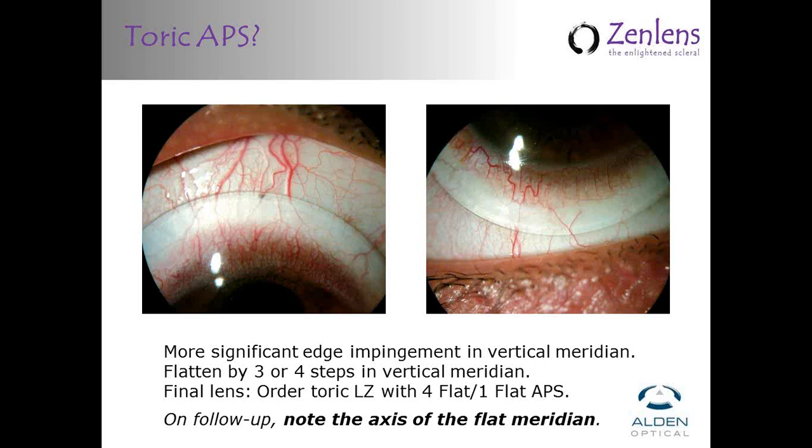And also, perhaps even more important, is if the eventuality comes up that you need to put front toric optics on this lens. One of the ways we stabilize a lens is if you have a toric peripheral system. We need to know where that flat axis is aligned as precisely as possible on the eye, so that once we know that, it allows the lathe to cut in the cylinder on the front of the lens and put it at the axis where you want it, where you tell us you want it at axis 115. The only way we can get it there is if we know how the lens is going to align on the eye relative to that flat axis.